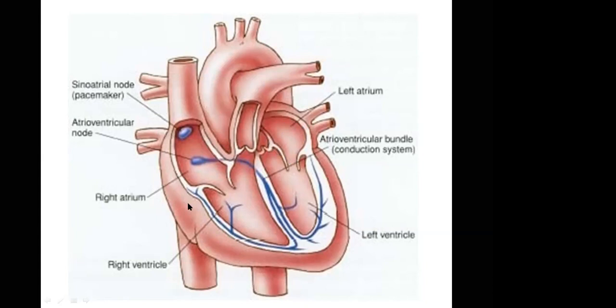So as I said, access into the atrium is through the inferior vena cava for all the catheters. You can pass as many as 4 or 5 catheters through the IVC. They all pass through the IVC and will be placed at the different segments I've described: in the atrium, around the His bundle, in the apex, in the coronary sinus, or you get access to the left atrium. That's how the catheters are passed. You can make multiple punctures in the femoral vein, 4 or 5 punctures, it doesn't matter, as long as it's a vein, and pass different catheters through.